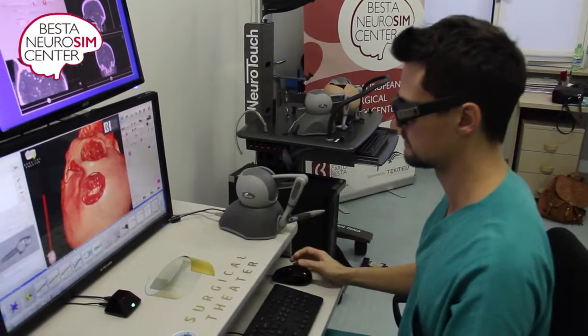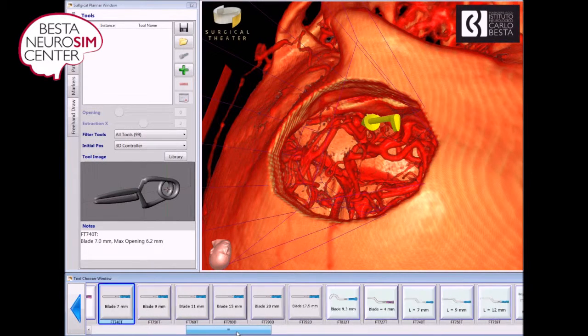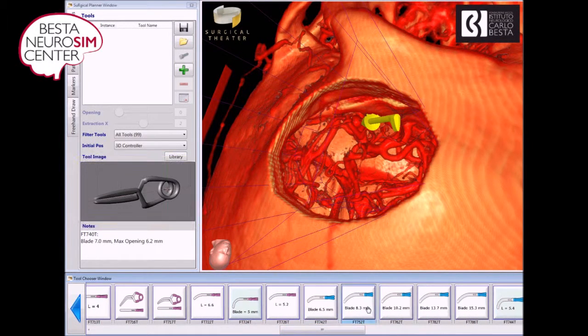For the second part, you will move on to the next working station. Taking into account the anatomy of the patient you saw before, you will have to choose between the use of a straight clip or a curved clip.